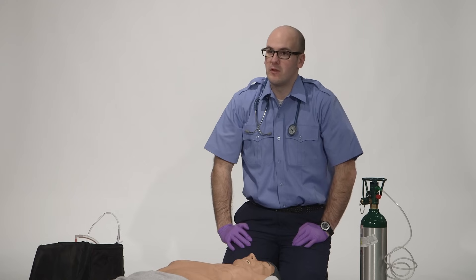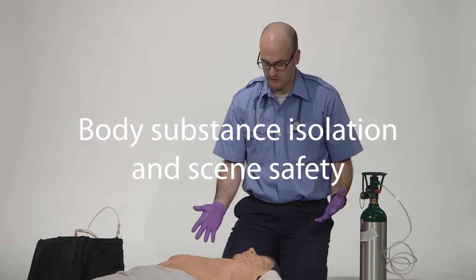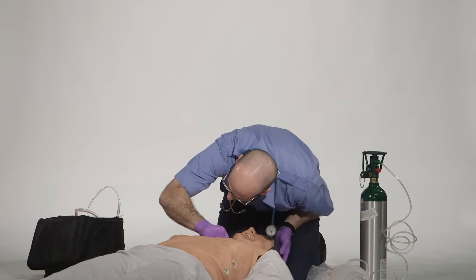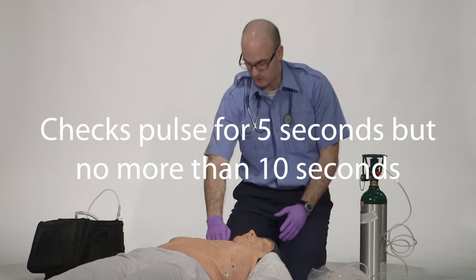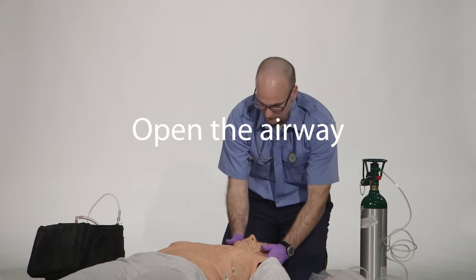The candidate must first take or verbalize appropriate body substance isolation precautions. Check responsiveness and breathing and request additional EMS assistance. Check the pulse for at least 5 seconds but no more than 10 seconds and open the airway properly.